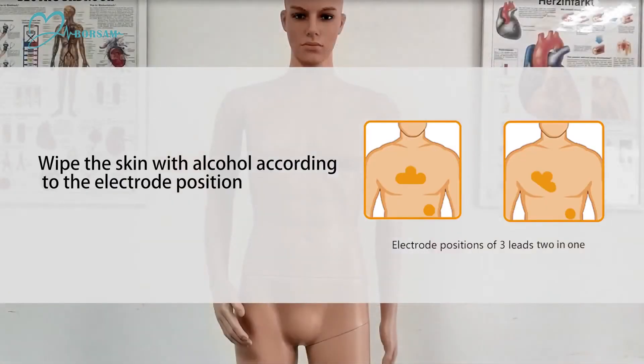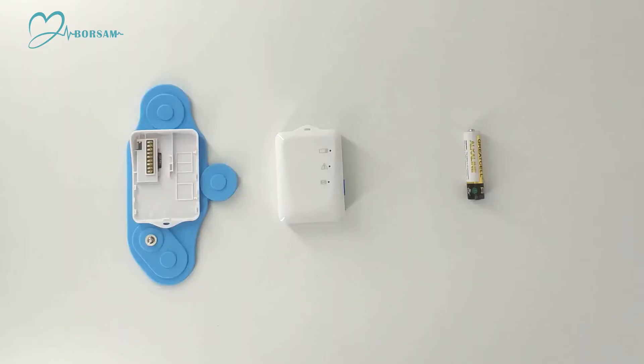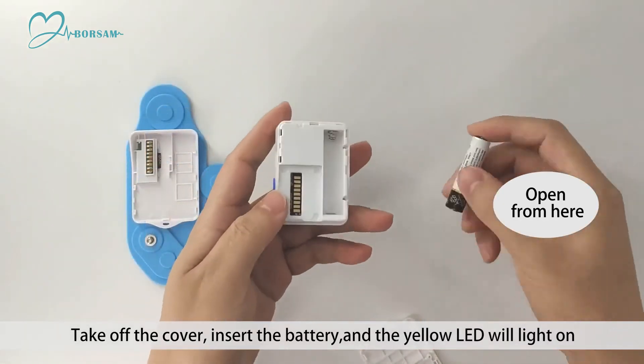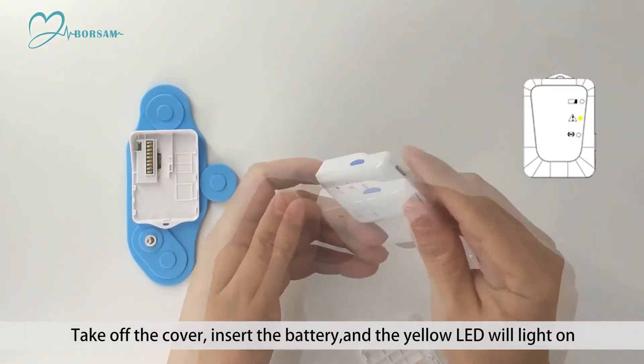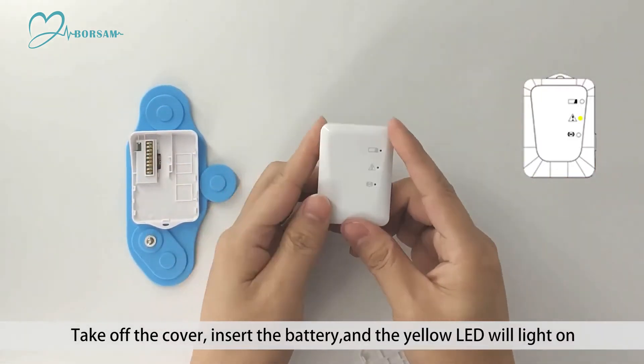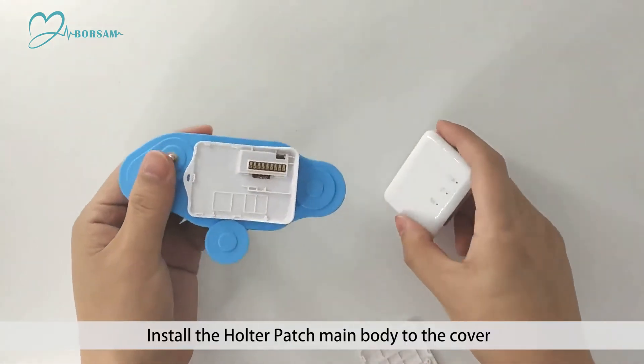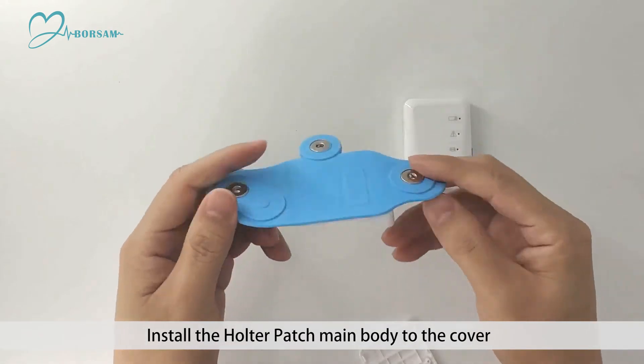Wipe the skin with alcohol according to the electrode position. Take off the cover, insert the battery, and the yellow LED will light on. Install the Holter patch main body to the cover.